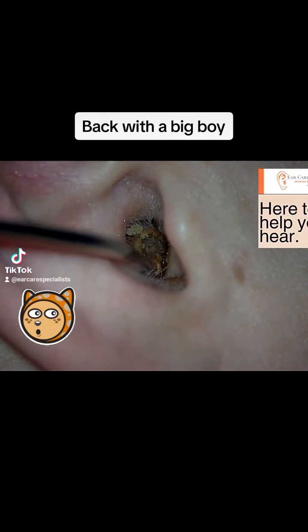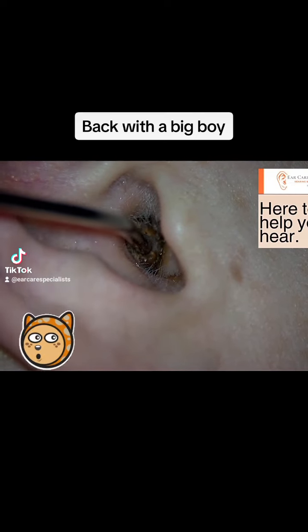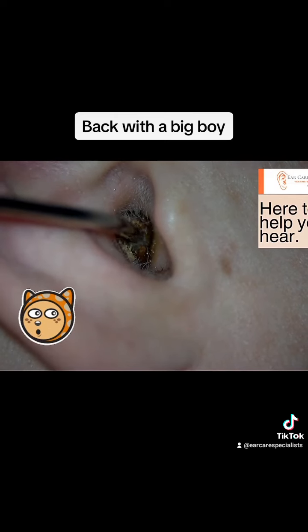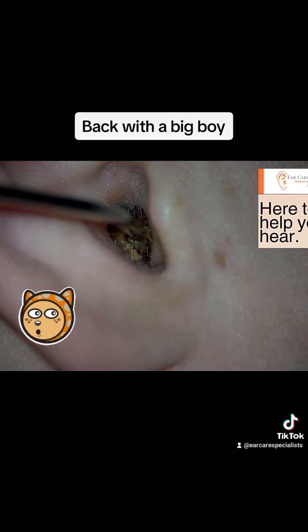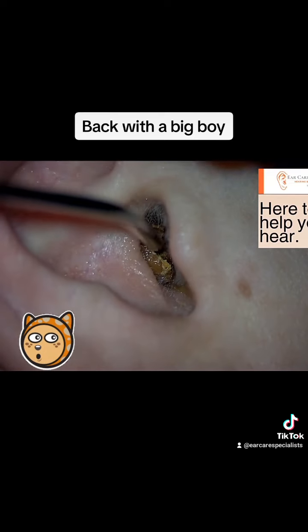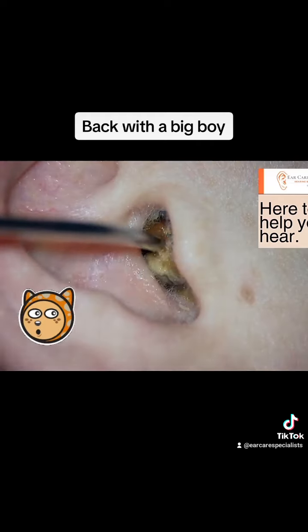So we're getting it just to the canal entrance, and this is the point where it was just getting a bit stuck. So give it a wiggle, just be patient, and eventually it will come out for us. Here we go, almost there. Imagine having this stuck in your ear. Here we go. So out it pops.